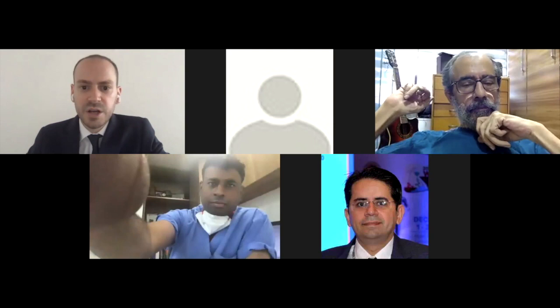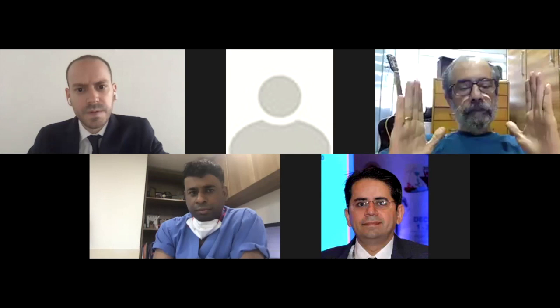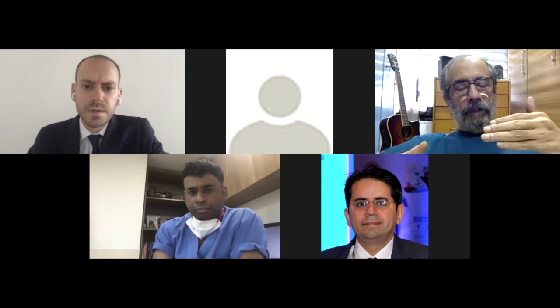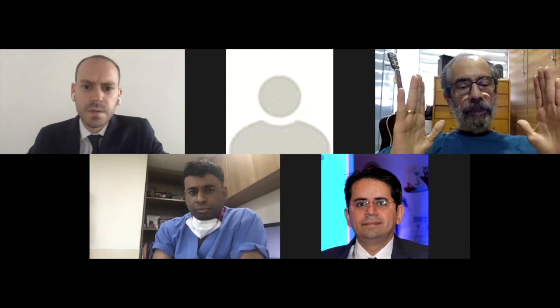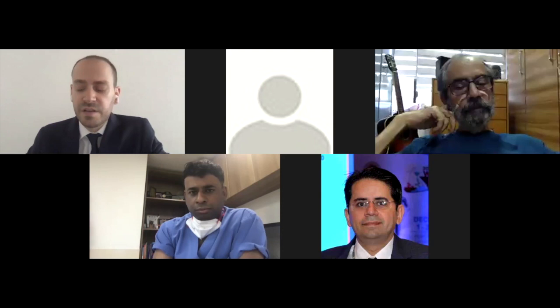Because one of the problems with any machine which calibrates itself is that if you've got a thick thigh, or a thin thigh, that's going to make a difference. And we are measuring 6 millimeters, 7 millimeters. So having the bone that far away from the X-ray plate will give you a magnification, even if you have an automatically calibrated machine. That's something we need to solve here.